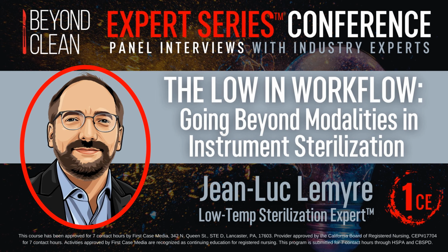Yeah, that's really helpful. Having used low temp sterilizers, there are a lot more considerations about lumen length and the number of lumens that can go in there. So what are some of the limitations of low temp sterilization and the technology we have today, and the types of things that we can sterilize?